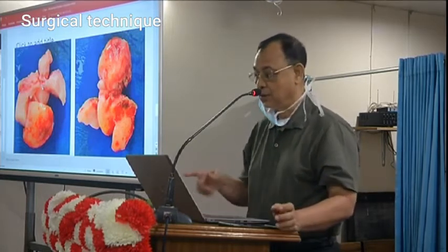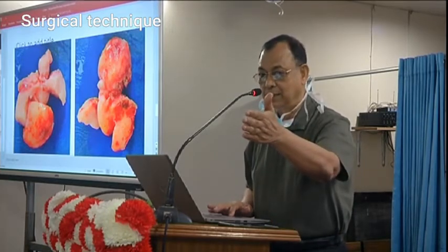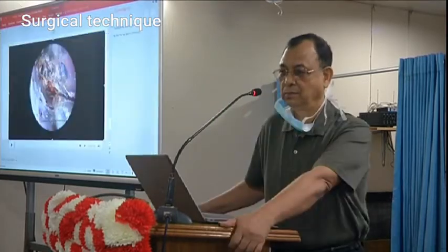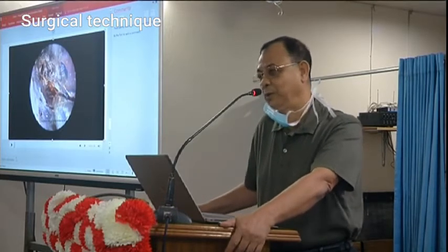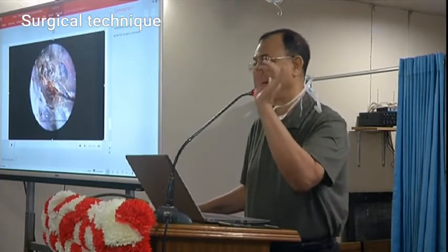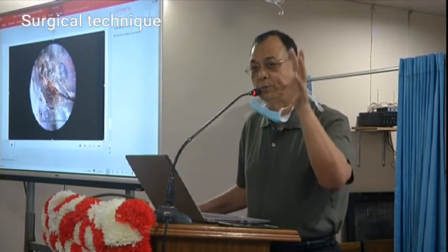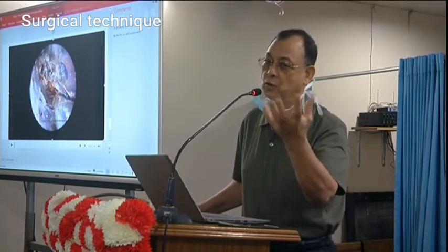So this is the whole mass. You see the bony part, that is the sphenopalatine region, as Professor Babur was telling. That is the bony part, and that is the mass. Actually, I told you at the beginning, the angiofibroma traverses through the foramina. That is the hallmark, that is the principle. If it remains in and around the sphenopalatine foramen, it remains in the nasopharynx, in the posterior part, in the choana. If it goes laterally, it harbors in the pterygopalatine fossa.